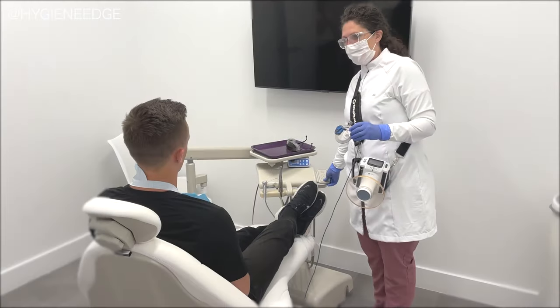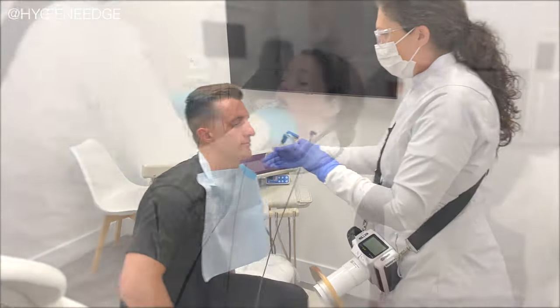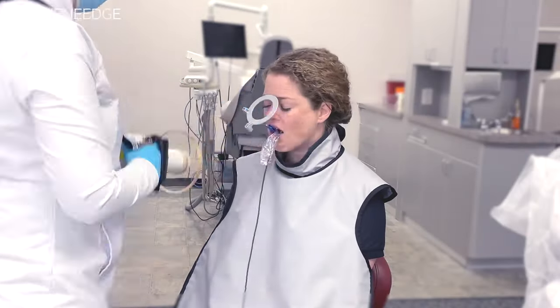If the patient chair is in the way, you can have the patient swing their legs off the side of the chair towards you, or you may even choose to do the whole procedure with the patient in a different chair.